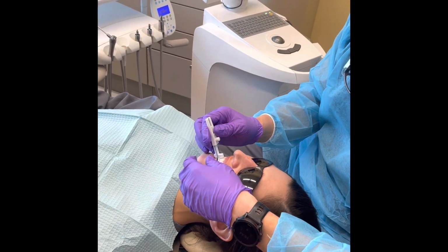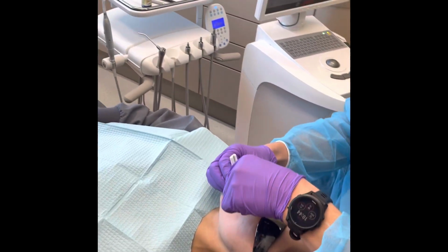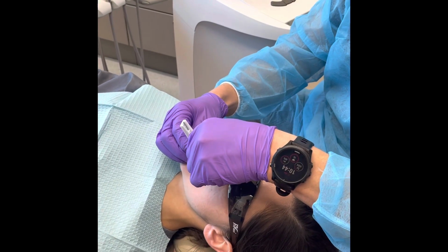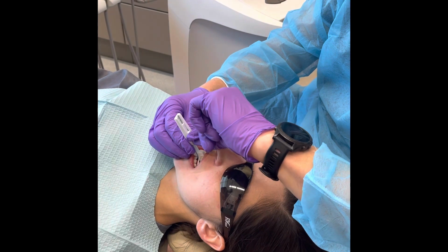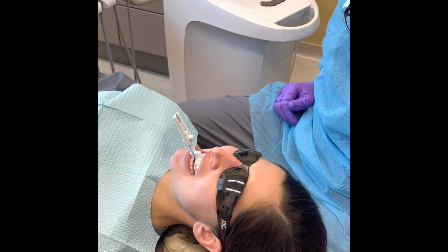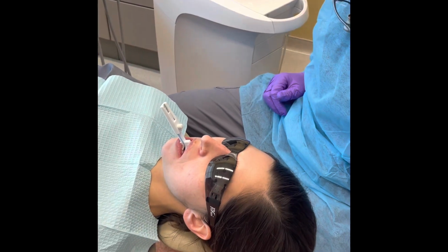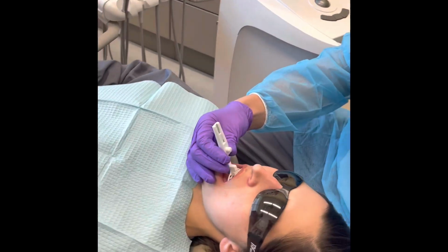Let's move you back a little bit. Okay. I'm going to try kind of bringing you back ever so slightly. Go ahead and slide your jaw back just a little bit. Perfect, right there. How does that feel to your jaw? Thumbs up, thumbs down, or kind of thumbs up? Uh-huh. Okay. Let's go ahead and we're going to scan you right here, okay?